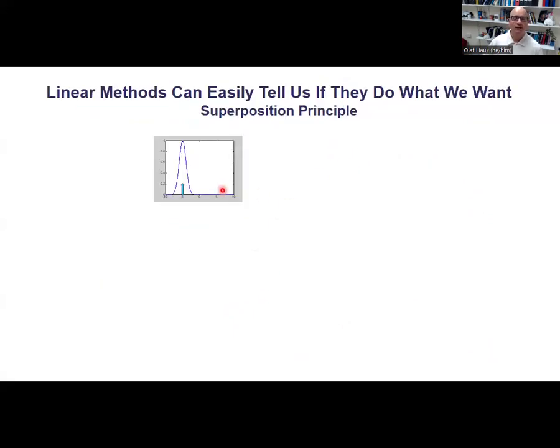And also to highlight the idea again, so now we're getting a little bit closer to what we are trying to do. They provide us with some methods to look at our specific measurement configuration and see what's going on there. So imagine you have a source estimation method, and if there's a dipole in this location, it always gives you this kind of source estimate.